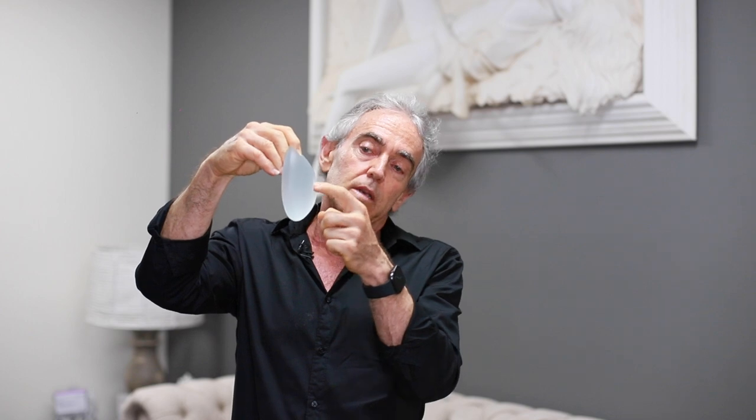The round implant is different in that it has more fullness above the nipple. The nipple sits centrally in the middle of the implant, which gives more fullness above the nipple for those people that are really hollow above the breast.